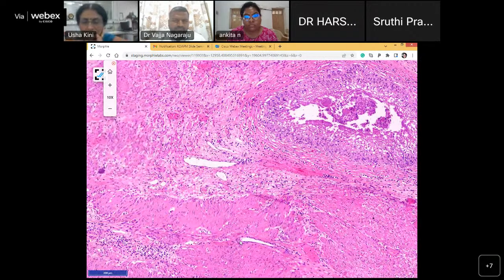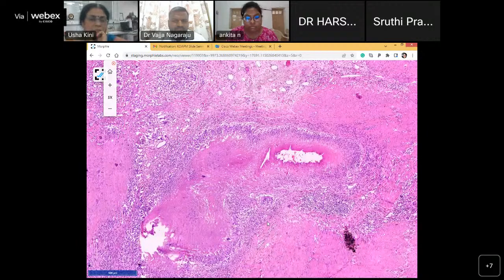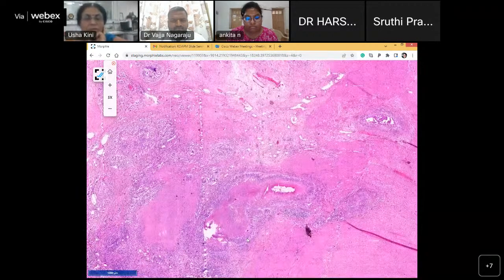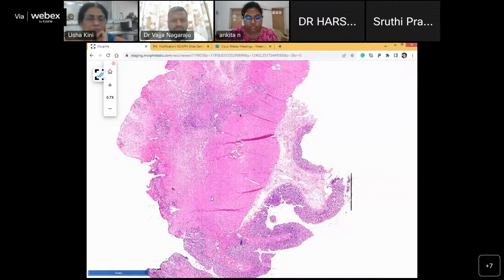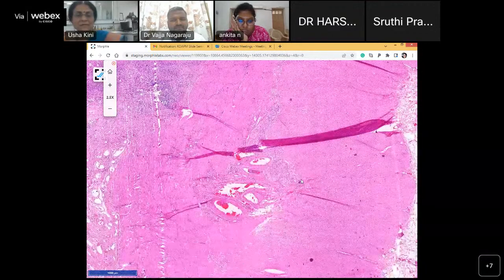You showed they were like rope. Where did they go now? Here they are. This is one location where you found the nerves so thick, like rope, right? But at the same time, you have ganglion cells by the side.